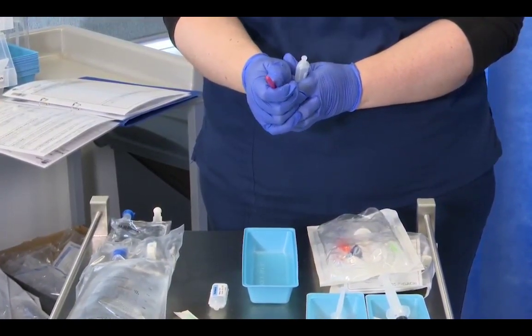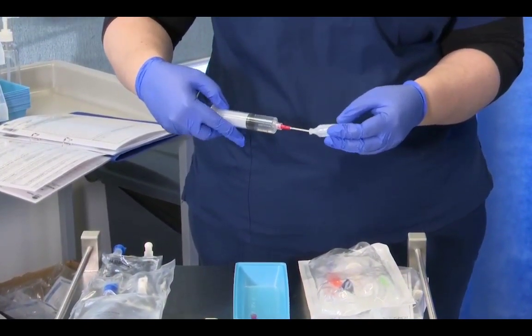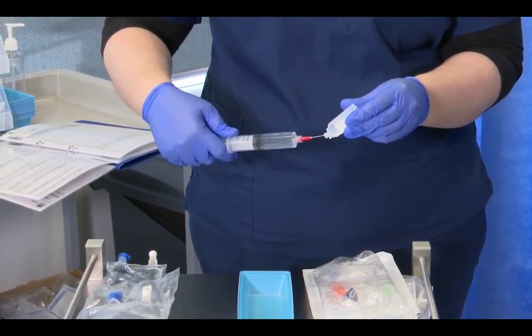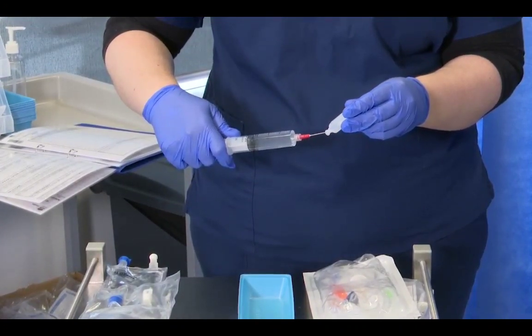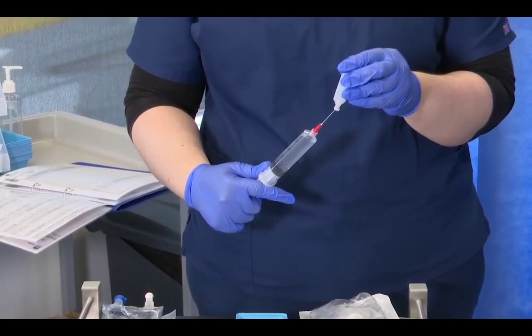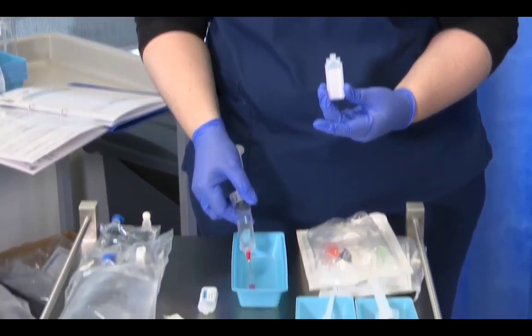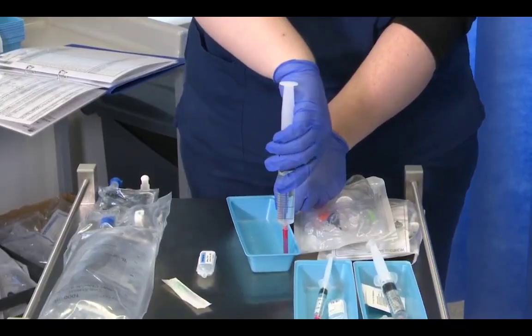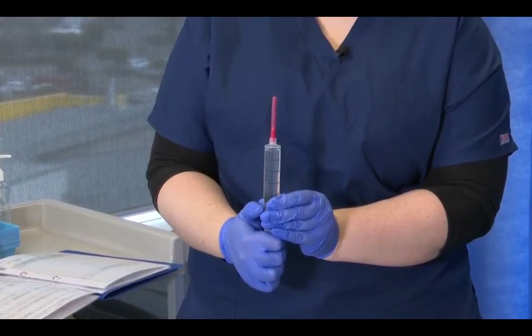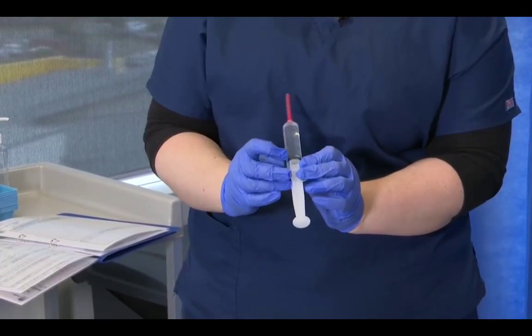Second cap off, and the red cap comes off our needle, and again straight in, keeping the needle under the water and drawing up the full 20 mils of our fentanyl till there's none left in our ampule. And again, red cap on, keeping the ampule, and we remove the air, at which time we have our neat 20 mils.